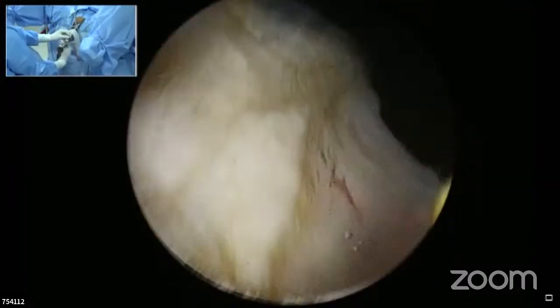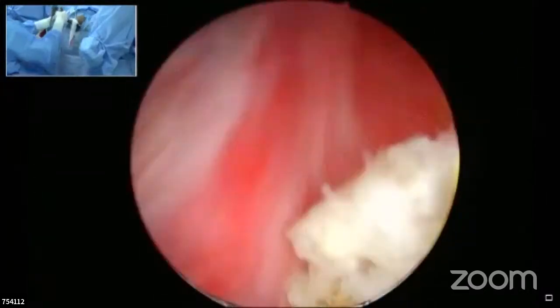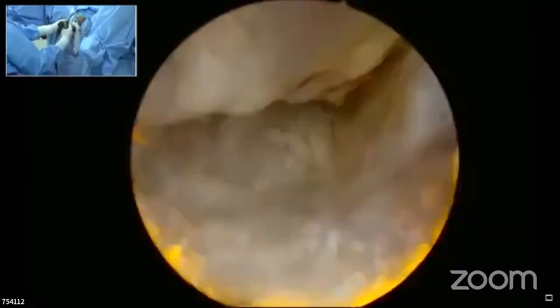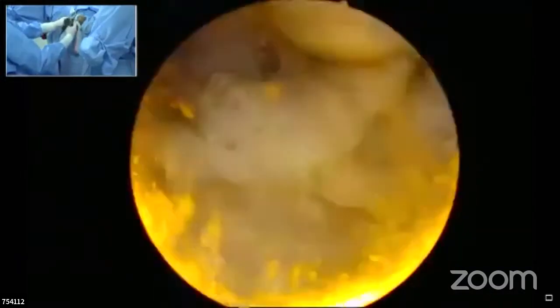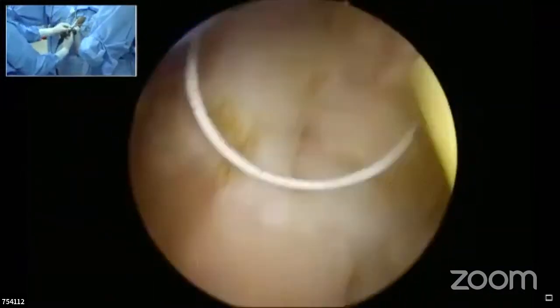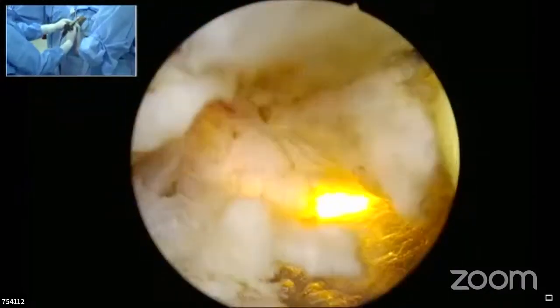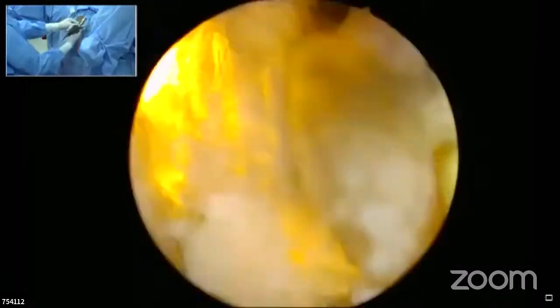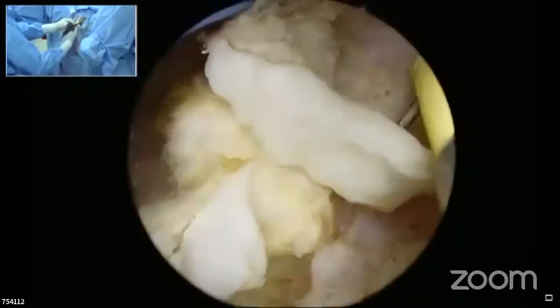So we have debulked the gland to some extent. Still some amount of tissue, rather a large amount of tissue still remains. So here we can take thicker chips and at a faster pace until we reach the capsule.